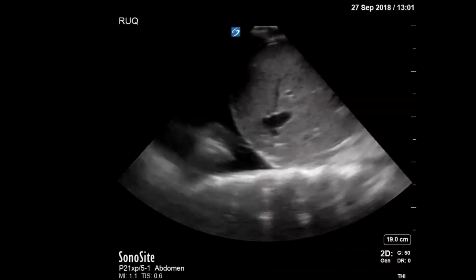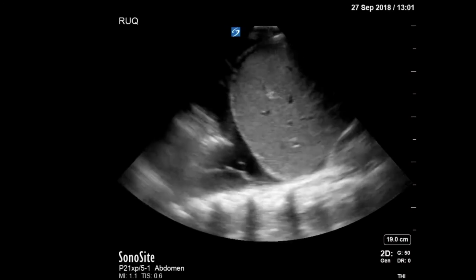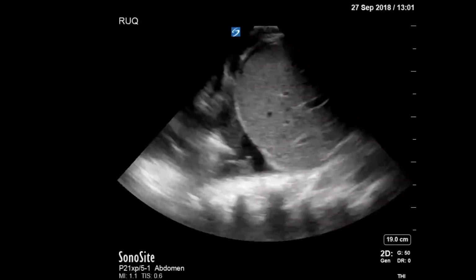This is a good example of a consolidation with a pleural effusion close to the liver. The echogenicity of the liver is generally different enough from the lung that an experienced eye can determine this easily, but it is nonetheless critical to find the diaphragm.